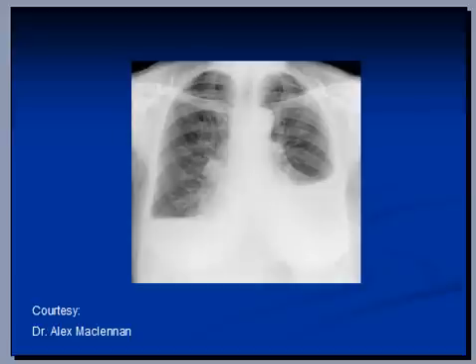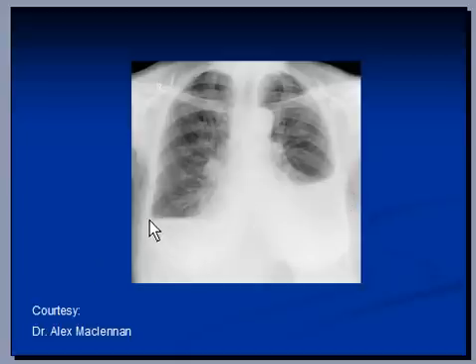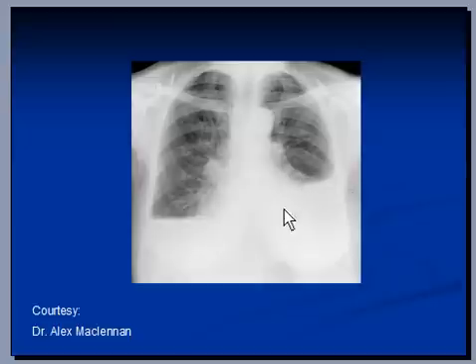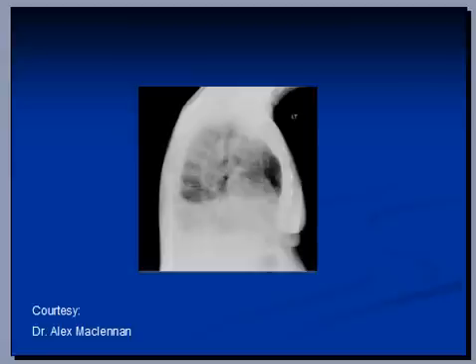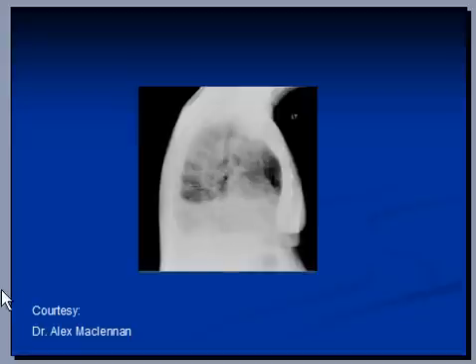This patient has bilateral pleural effusion on both the right side and the left side. The effusion is large enough to create a fluid level on both sides. Looking at the lateral view of this patient, you can again see two fluid levels indicating bilateral pleural effusion.